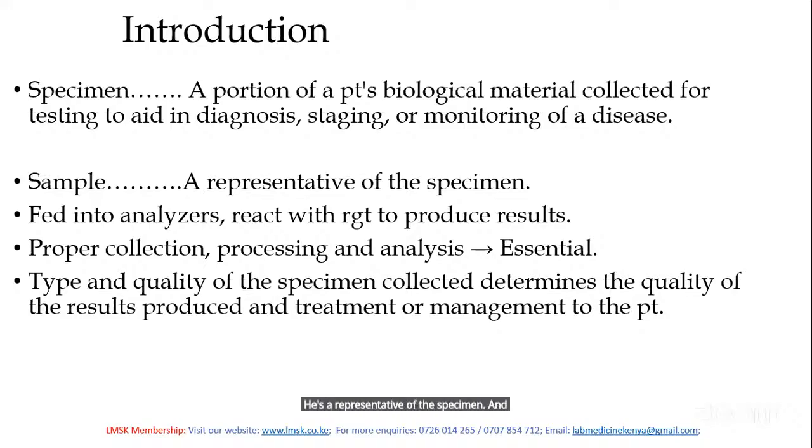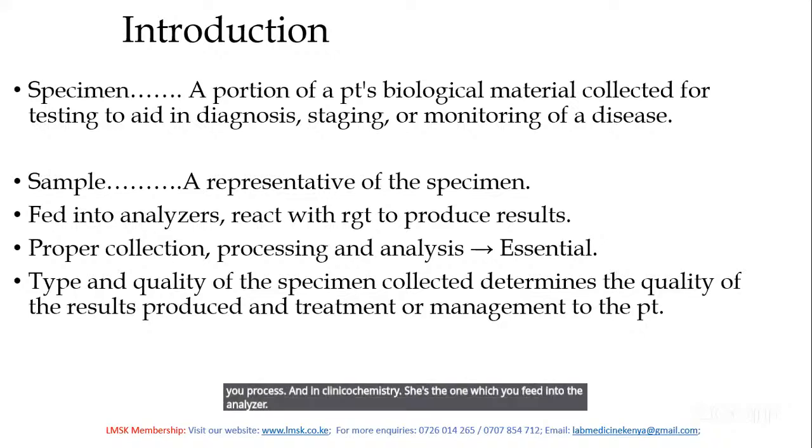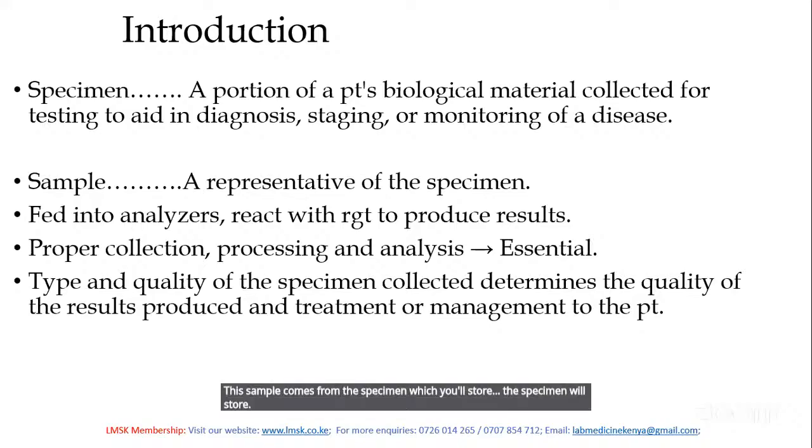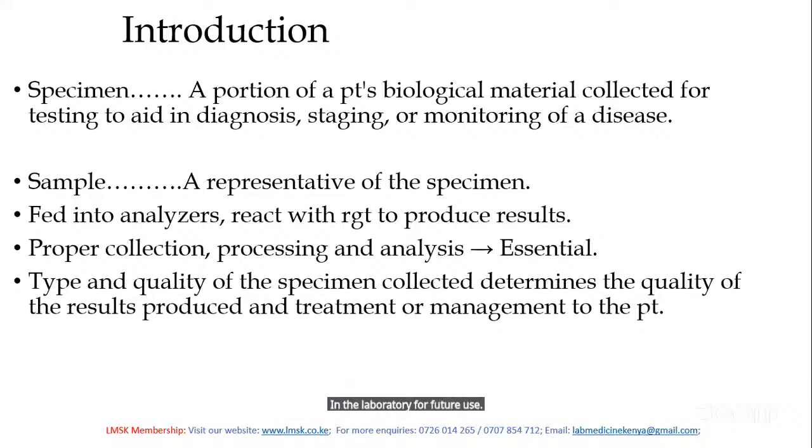And it is this sample that you process. In clinical chemistry, it is the one which you feed into the analyzer. A reaction with the reagent takes place and the results are produced. So it is the sample which we feed in the analyzer. This sample comes from the specimen which you will store in the laboratory for future use. That's the difference.